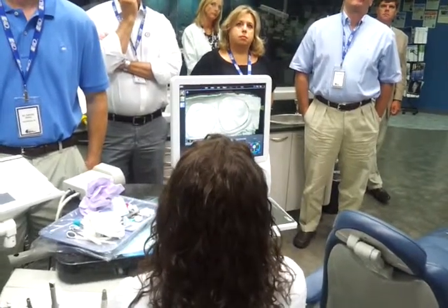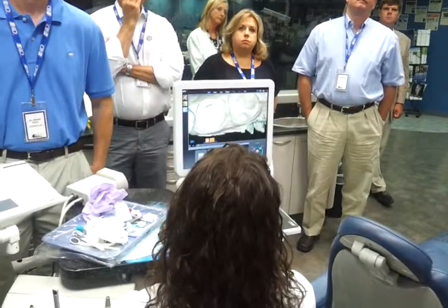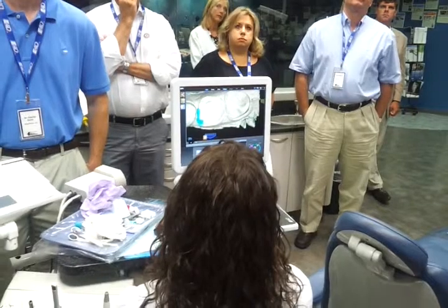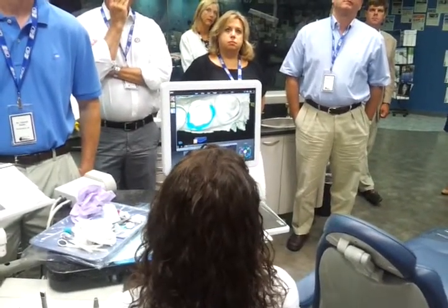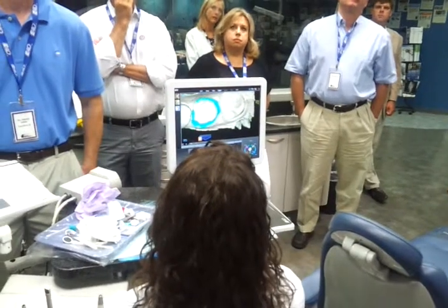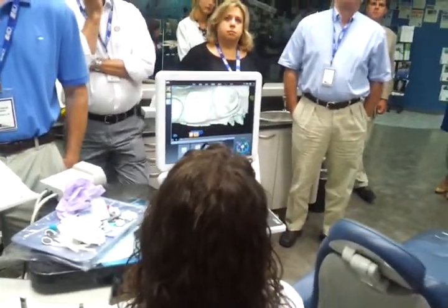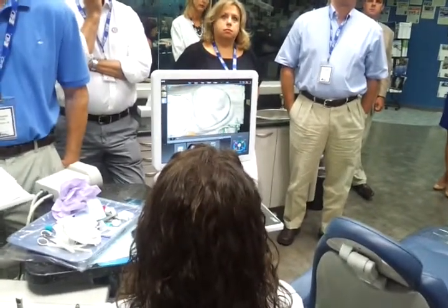So same thing here. I can utilize another tool, but like I told you, if I was to utilize my paint, paint is for supragingival preps. I'm just going to left click here and paint my margin. But what you'll notice is I'm going to have a lot more editing to do because it's not 100% supragingival. So I'm going to get a little bit more of a bumpy line. Not bad though. So here I'm going to fix that area where it was subgingival.